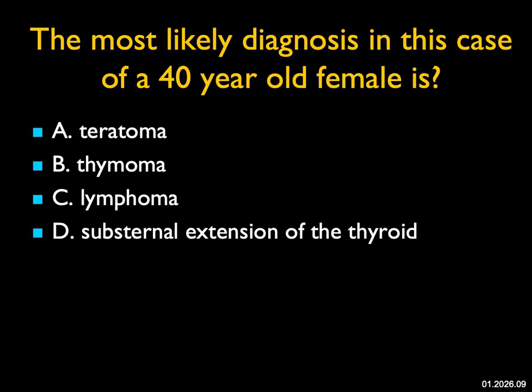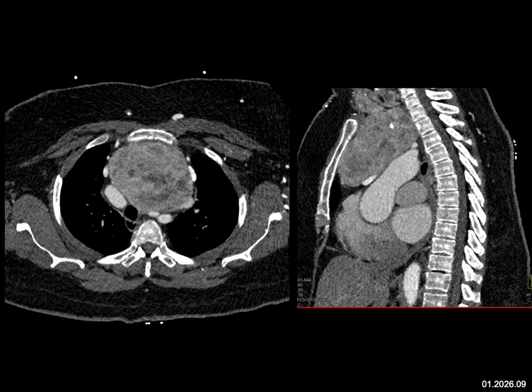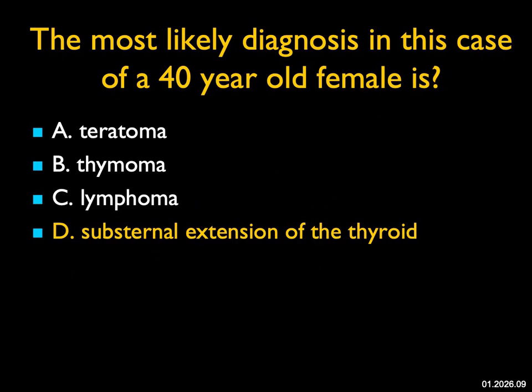The most likely diagnosis in this 40-year-old female: we see a large anterior mediastinal mass, solid with some areas of low density, and on the sagittal view it comes up into the neck. From the axials, teratoma, thymoma, or lymphoma are all possibilities. But its high extension, vascular nature, and several punctate calcifications make this much more likely to be a substernal extension of the thyroid gland — which it indeed was. Just a very nice example.